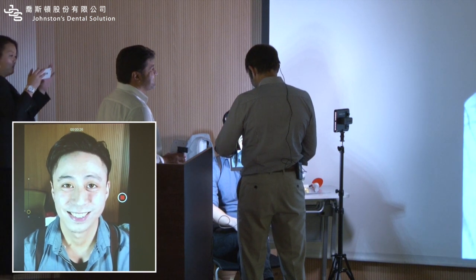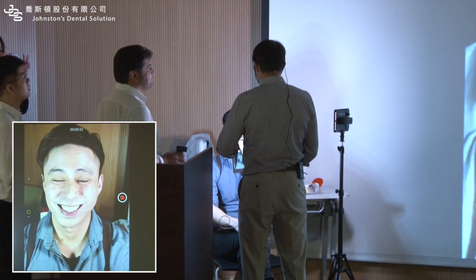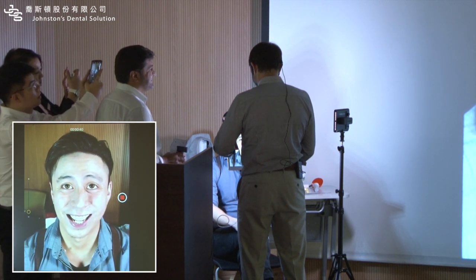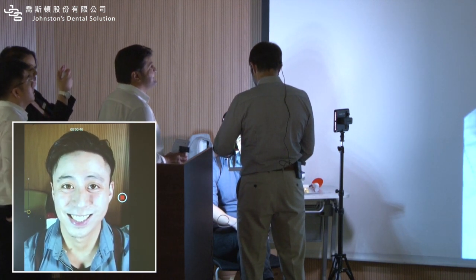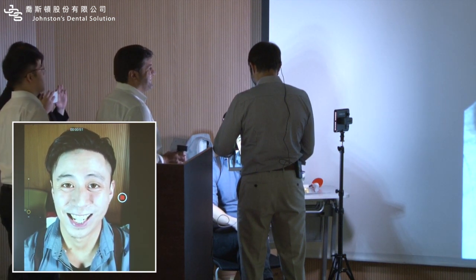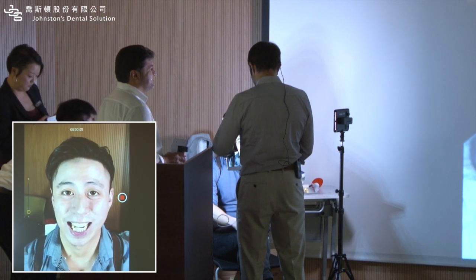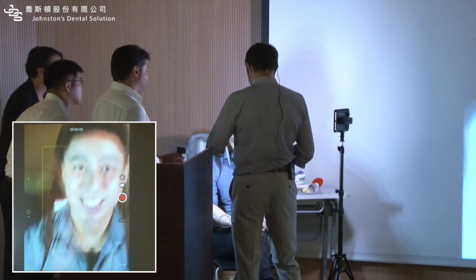And now I need a smile where you separate your teeth a little bit. Opening a little bit. More. Stretch now. Show your gum. Yeah. You can do better than that. And separate. Open more. Yeah. Now show more of the uppers. Yes. Yeah, that's good. Let's see what we have.